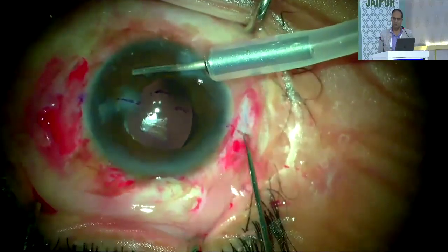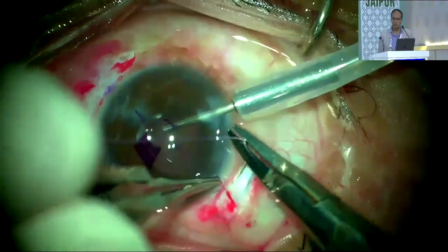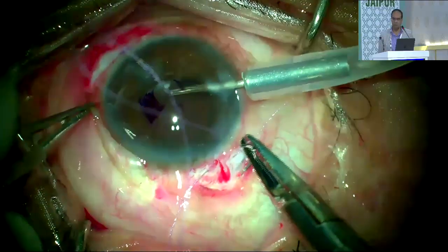Then the centration is adjusted as desired. Then the scleral grooves are sutured with 8-0 Vicryl sutures to secure the haptics in place.